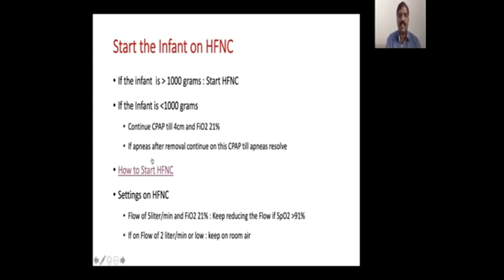And how do we start HFNC? What do we do with HFNC? I think Dr. Shalini will discuss with us. So whenever you're going from CPAP to HFNC, we maintain the same flow and FiO2 21% or up to 25%.